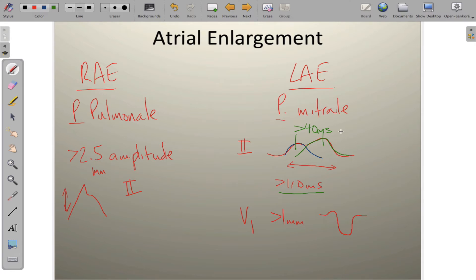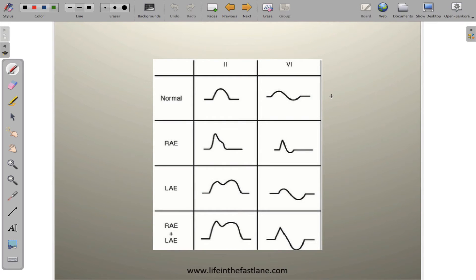I won't spend a lot of time on EKG examples here. Remember that EKG testing for atrial and ventricular enlargement or hypertrophy is highly specific but extremely insensitive. Diagnosis of right or left atrial changes or ventricular hypertrophy is accomplished by echocardiography, not by EKG. This is from colleagues at Life in the Fast Lane — Mike Cadigan and colleagues — and it's a great chart summarizing P-wave changes with right, left, or biatrial enlargement.